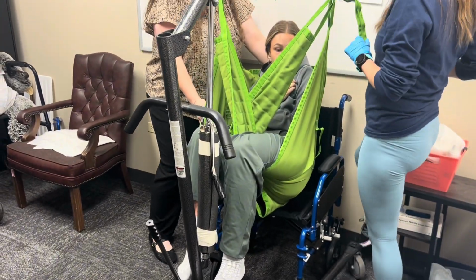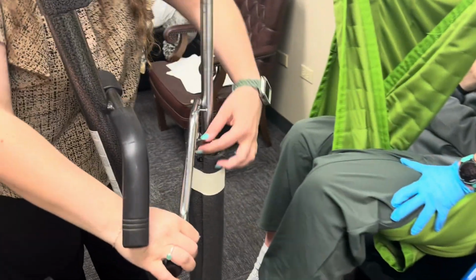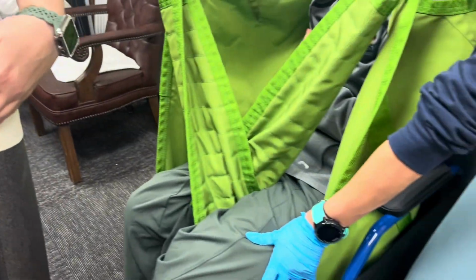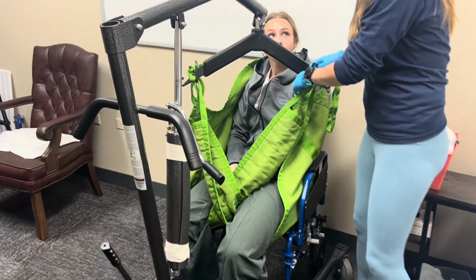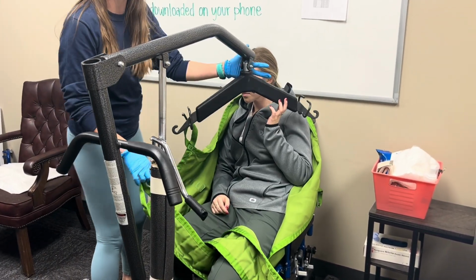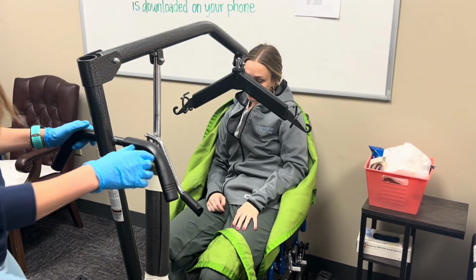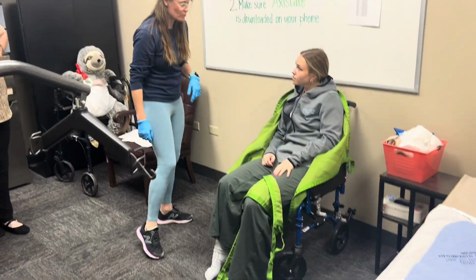So Mary, do you mind just lowering the Hoyer? What I'm going to do is just pull the sling back. Okay, we're good. Are you ready? Yep. Okay, 1, 2, 3. Perfect. So the safe thing to do for skin, and the preferred method, would be being mindful of our clients' heads. So I'm going to unlock the Hoyer, and I'm going to move it away from you. Now, my wheelchair was locked before we put you in there.